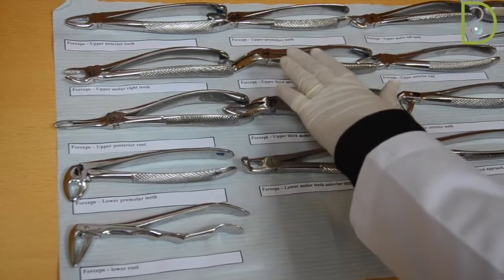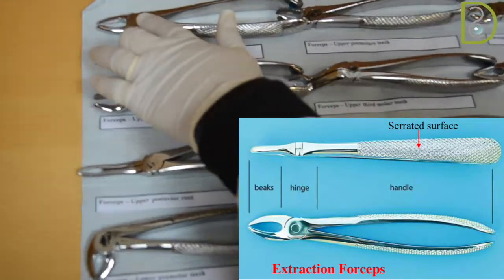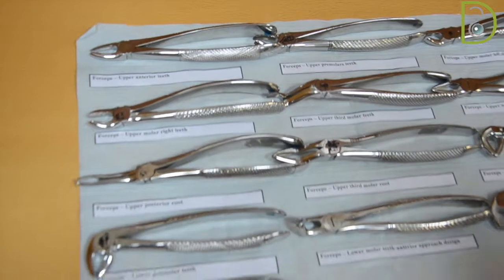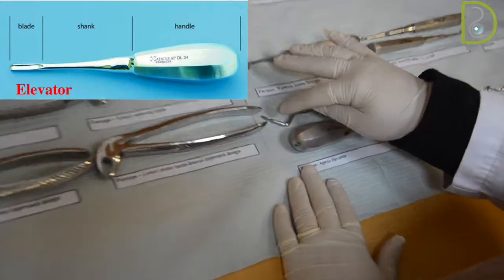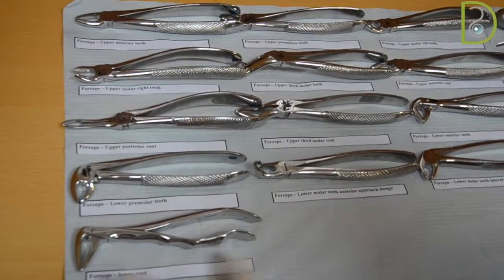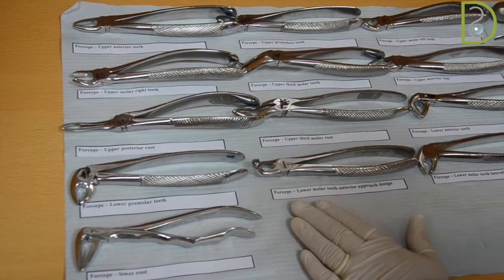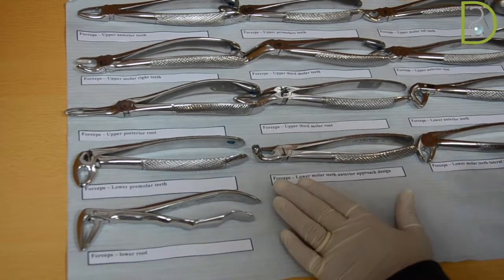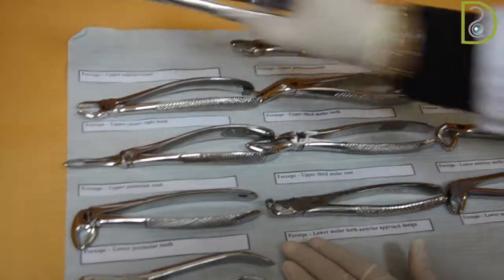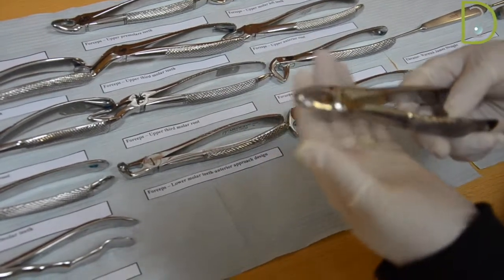The first of all are the forceps, and forceps are composed of a handle and a joint along with beak, while the elevators have a handle, a shank, and an applicable blade. Each one has a specific purpose and a specific function and a job to do. As for the forceps, most of the time they need something to grasp on. It's either a crown or a root, and there will be a change of the beak shapes accordingly.